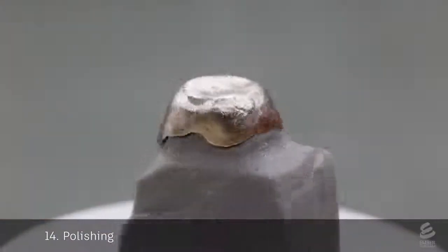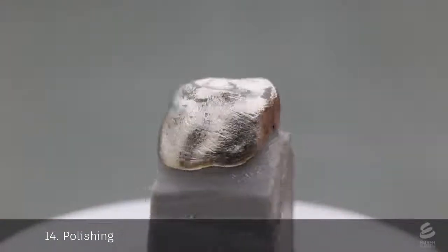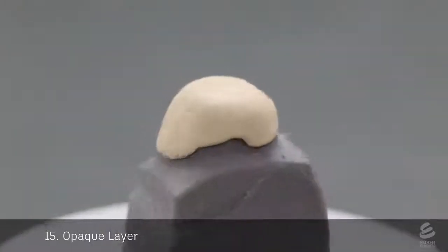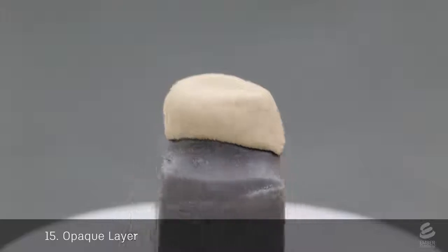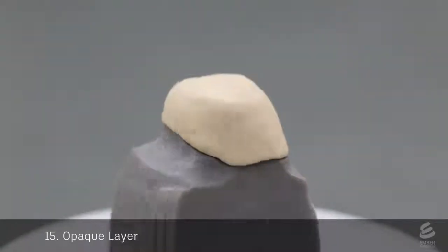This metal casting will form the substructure of the final crown. Next, an opaque layer is applied to the casting. It acts like a primer. It covers up the gray color of the metal and also increases adhesion with the porcelain layer.